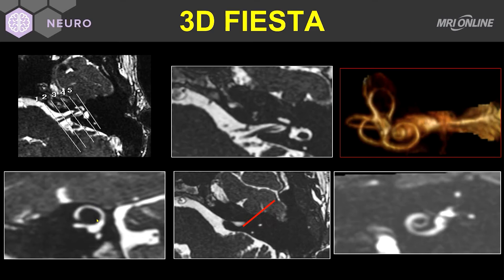These sections can be taken not only in multi-planar view, but we can also reconstruct in a 3D format and make MIP images or 3D volumetric images. Here you're nicely seeing the superior semicircular canal, the lateral semicircular canal, the posterior semicircular canal, and even the turns of the cochlea in a three-dimensional reconstruction.